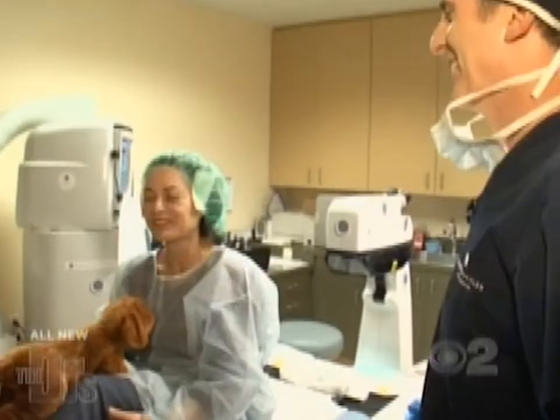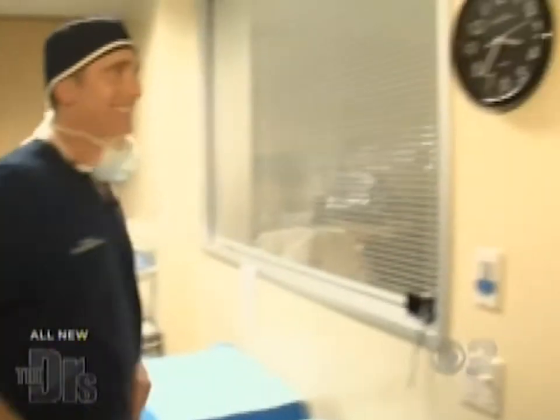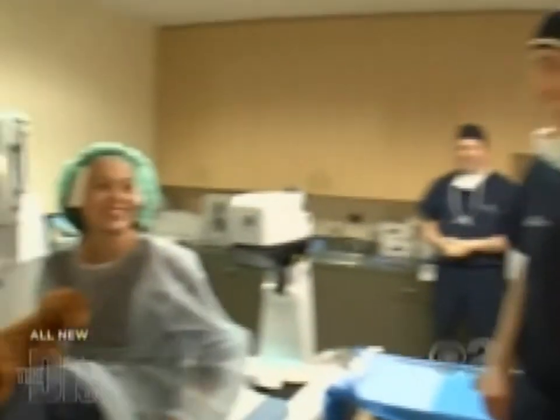It's surreal. Oh, I see a clock. Wow. I'm going to be able to see a clock without having glasses on.